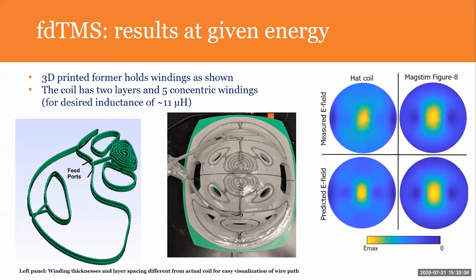We should probably try to see if there is something on their side that they have spotted that we haven't yet, and try to copy those, probably for higher efficiency, because the 2 layers here actually lose efficiency compared to 1 layer, but a 1-layer coil cannot be realized because the current density gets too large in the coil windings for managing the heating.